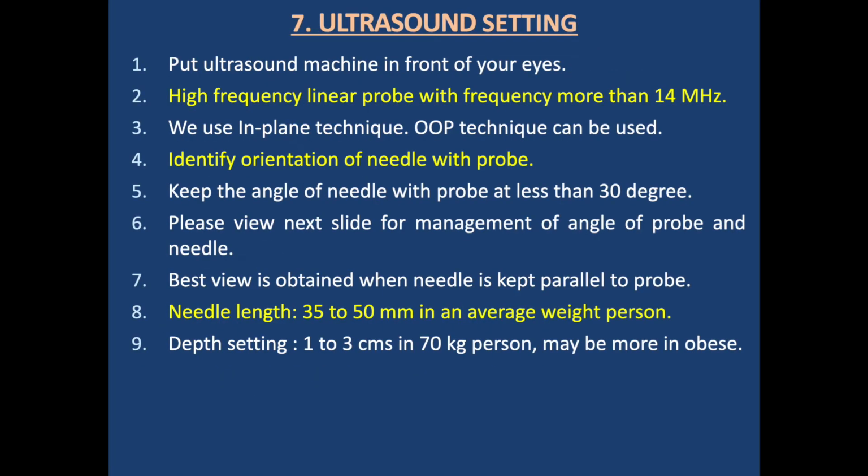Ultrasound setting. We always put the ultrasound machine in front of our eyes.